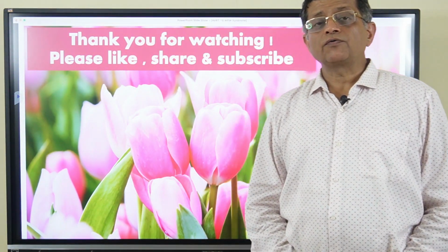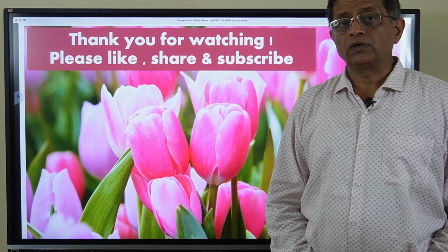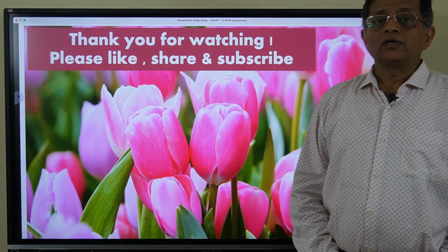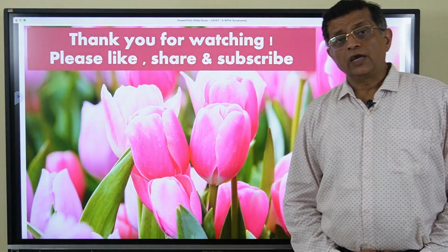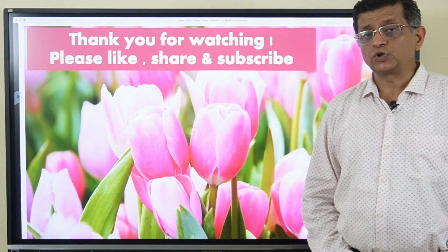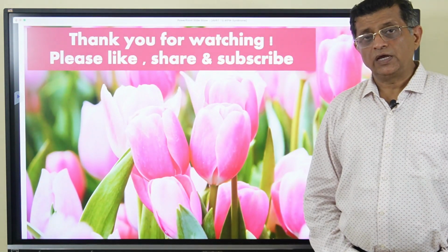In this video we have covered WPW syndrome, the pathophysiology, and the localization of the accessory pathway. In the next part, part 2, we will consider WPW syndrome related arrhythmias, AVRTs, and the treatment.